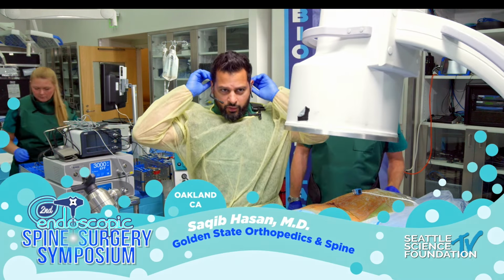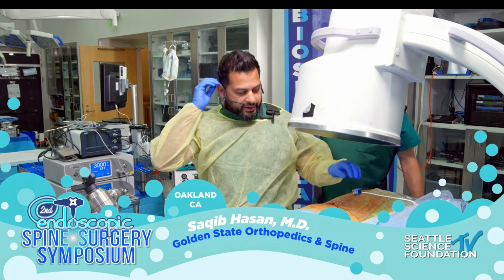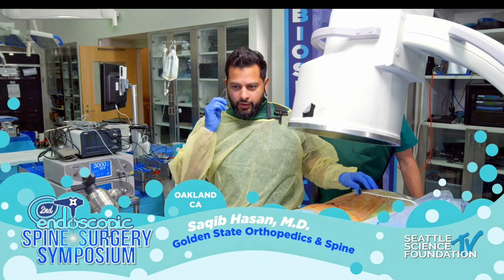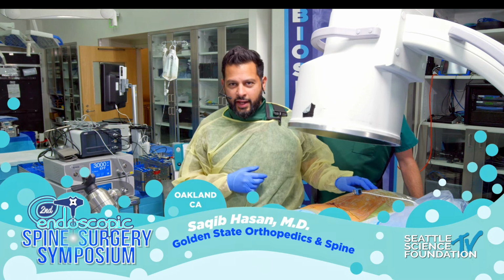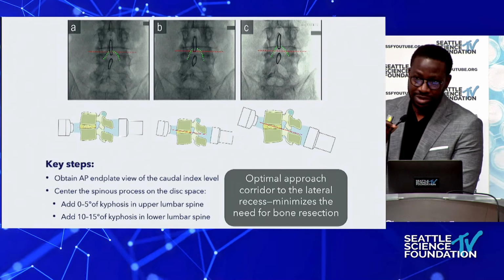So John, you can keep going because Meng was a real trooper and he used that last cadaver, but for the sake of all the attendees today, we're going to change the cadaver to make it a little bit easier to follow on X-ray. Okay. Thank you, Meng, for taking one for the team.